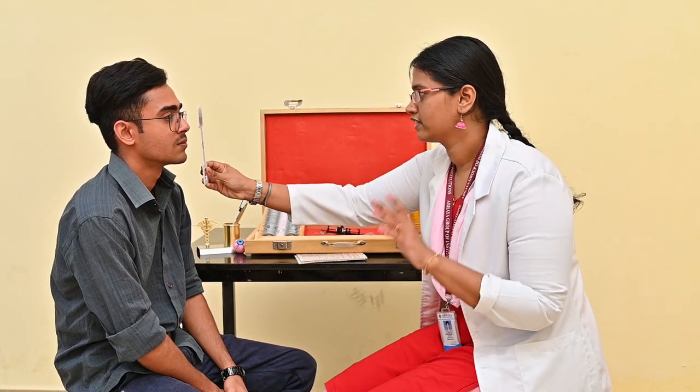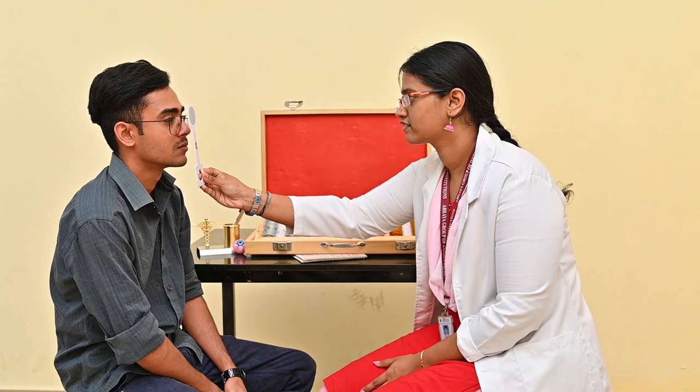Please look at 6/60. I am using an occluder to occlude the patient's eye. When you are doing the cover test, you are going to occlude one eye and observe the un-occluded fellow eye to see whether there is any deviation. I have done with the right eye — there is no deviation — so I move on to the left eye. When I am covering the right eye, I am seeing whether there is any deviation in the patient's left eye, and when I am covering the left eye, I am seeing whether there is any deviation in the right eye.